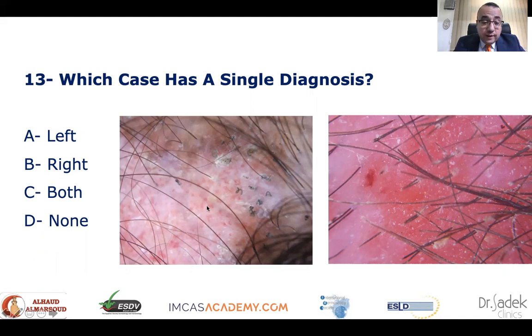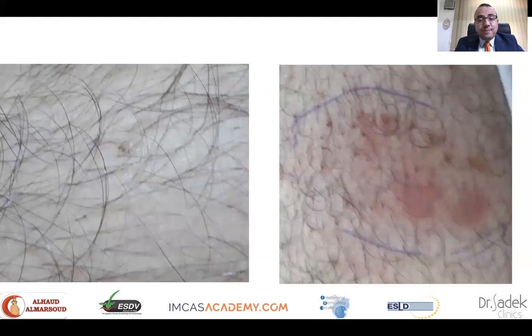And here we can see the findings of all those vasculature in the area of diffuse fibrosis. With the application of steroid for a prolonged time to treat the DLE, there was lowered immunity, and she acquired the infection at this site of tinea capitis as well, denoted by these corkscrew hairs. So both cases are suffering from multiple diagnoses.